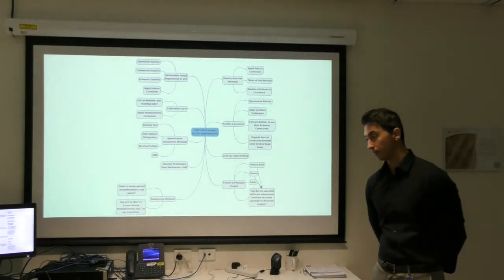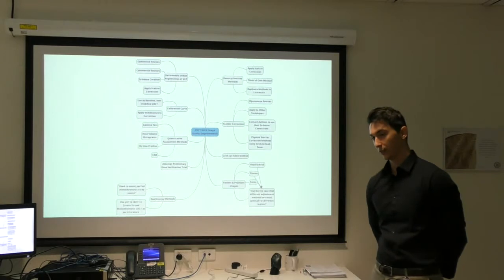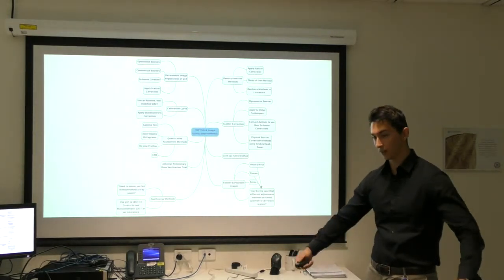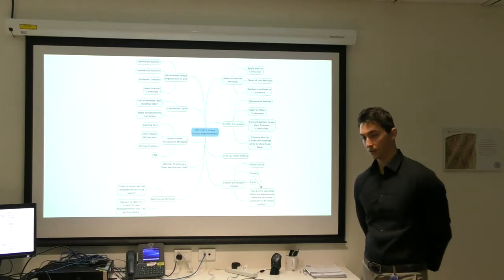and I think whatever results I come up with would be best served on looking at the pelvic and thorax regions, because the scatter conditions there are so much greater, just because of the cone beam shape, and by nature of the larger volume irradiated, more scatter occurs and more artifacts result.